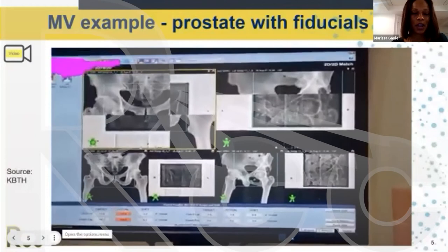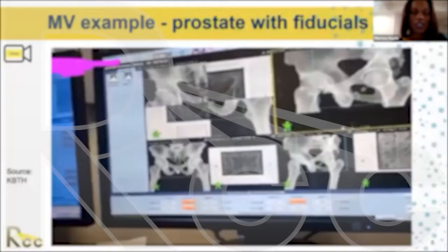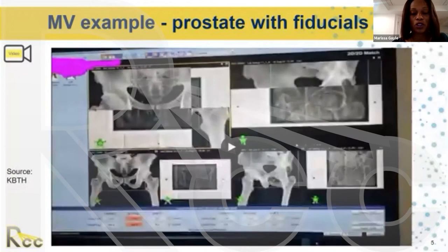Playing it again so everyone can visualize it — it goes by fast. Once the therapist is content with the setup, they apply the shifts, which are then applied so the patient will be in the correct positioning.